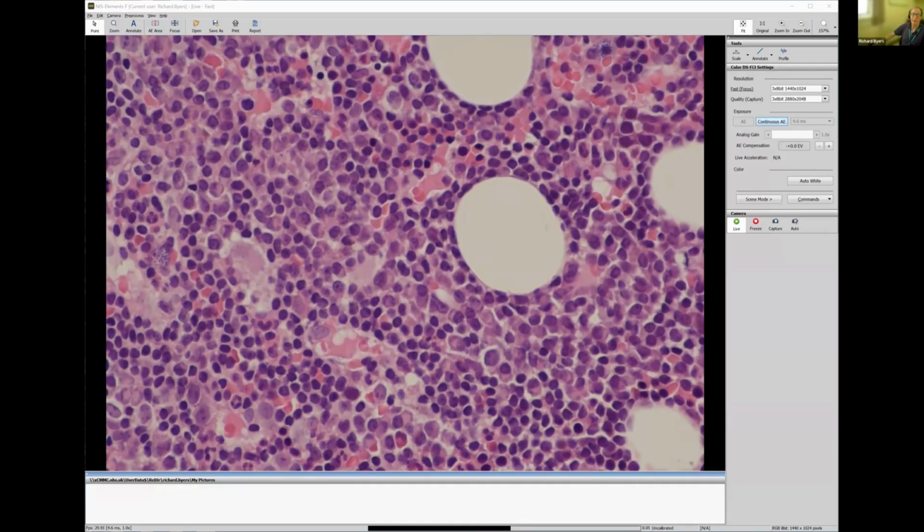So any suggestions from the audience as to what this might be? If anyone has any suggestions, just raise your hand and I can unmute you. Thank you.